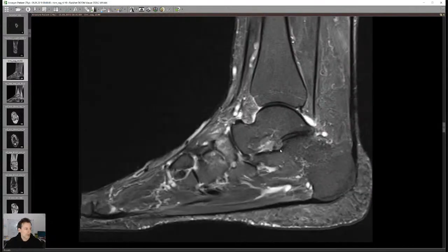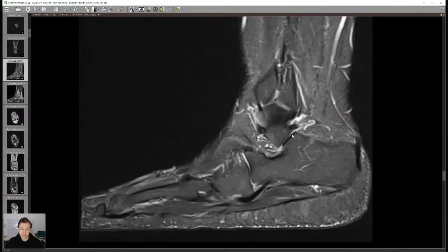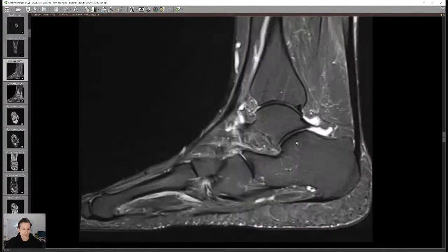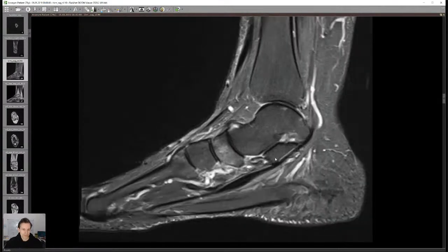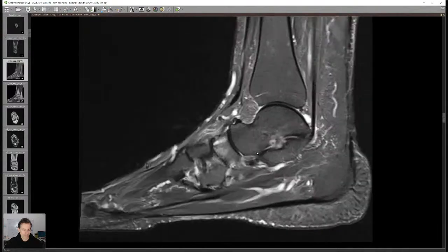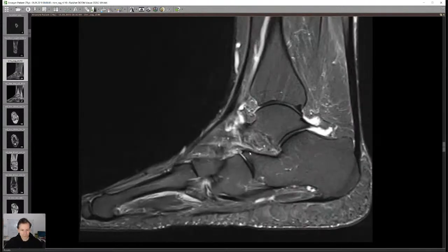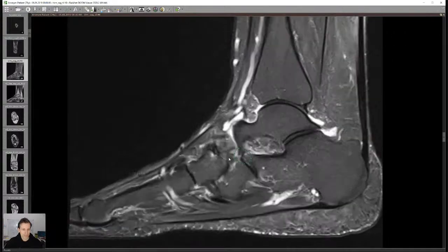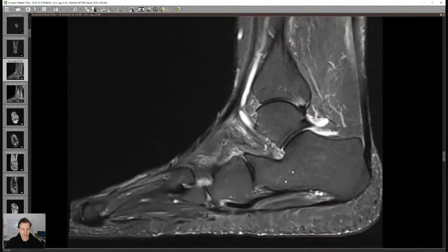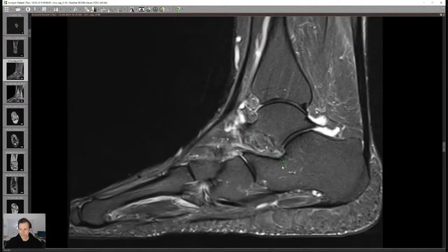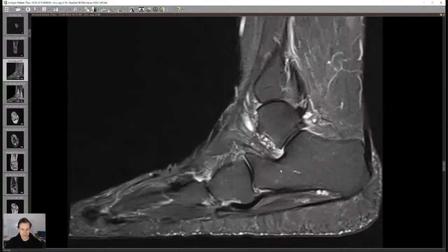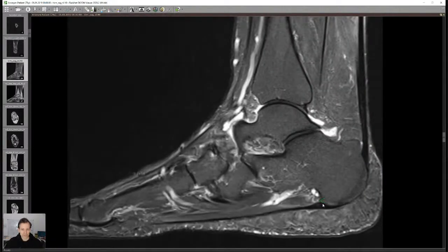Once we've assessed the ankle joint, we go to the subtalar joint and check for cartilage damage, coalition, and bone marrow edema on the posterior facet, middle, and anterior portions. Always give a close look to the anterior process of the calcaneus because you can have subtle fractures easily missed. Also check the rest of the calcaneus — don't miss intraosseous ganglia that can occur in Gissane's angle.